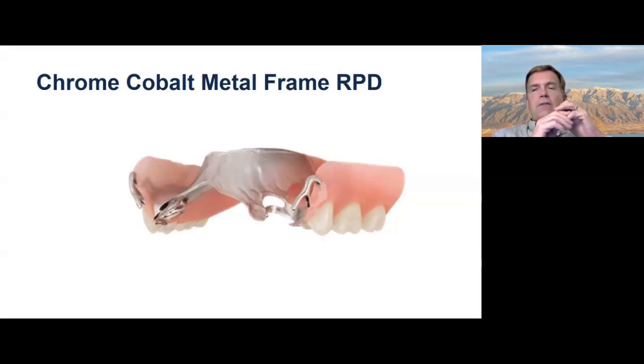Interestingly, though, meta-studies from 2022 of 21 in vitro and in vivo studies between 1995 and 2022 showed that while chrome cobalt isn't as biocompatible as titanium, it's much better than nickel. There's been no cytotoxicity in those studies to human cells. So I think this is still a viable option in 2024.